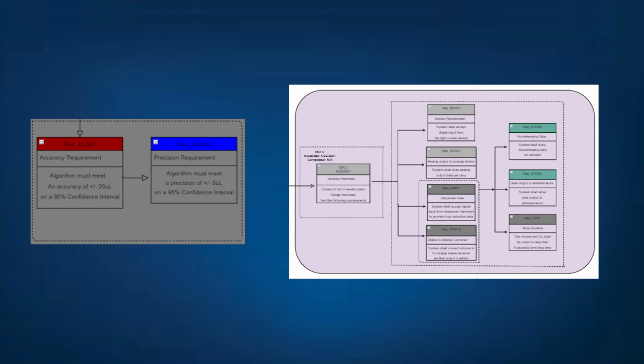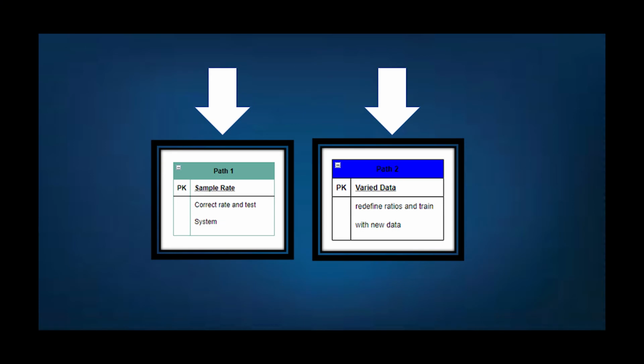Verification for the accuracy and precision requirements using the hardware implementation has not yet met the passing threshold. This is due to differences between the light sensor data from the training data and the verification data. We currently have 2 concurrent paths on the root cause, and we continue to work to resolve the issue in order to deliver a fully packaged, functional product.